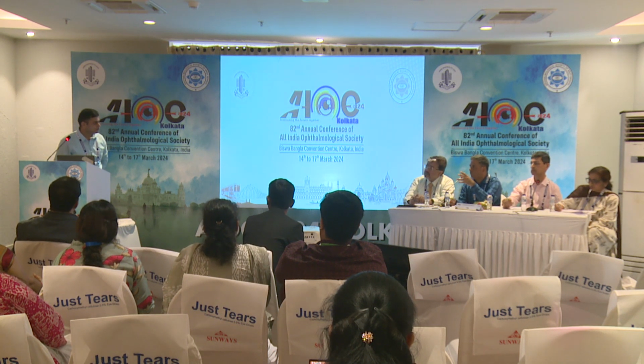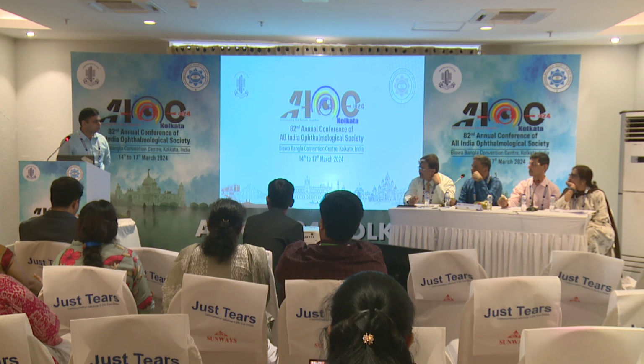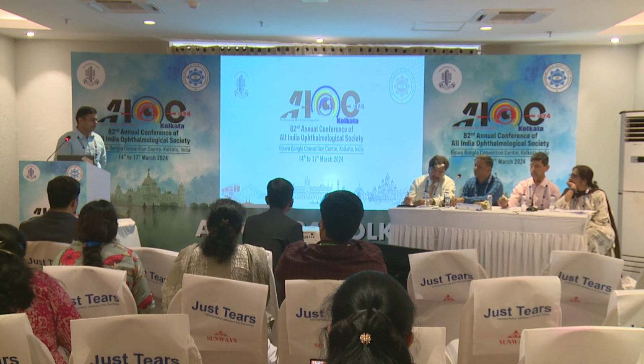How stable is that attachment? If the patient moves suddenly, how stable is it? It is quite stable, sir, with the surgical micropore, because the gonioscope is quite light, and it's quite stable and easy to take, sir.